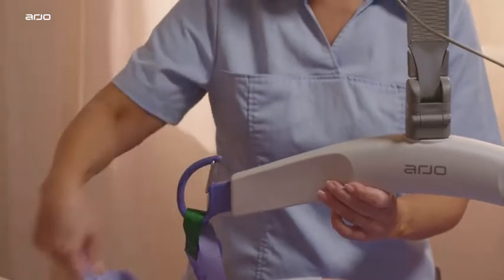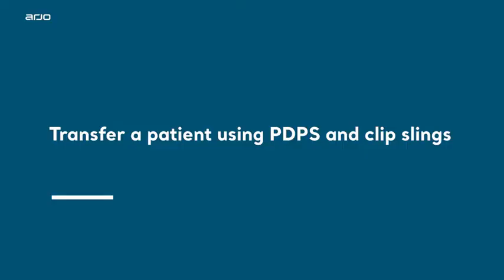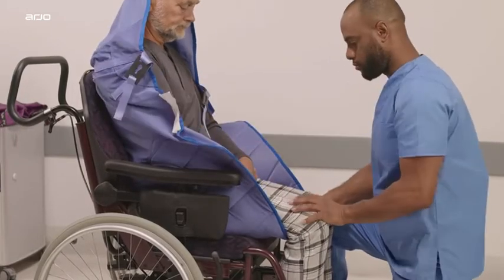Removing the sling from the spreader bar. Open the latch and remove the loop from the hook. Repeat the same procedure for all loops. Transfer a patient using PDPS and clip slings. Place the patient in the appropriate sling according to the sling's instructions.